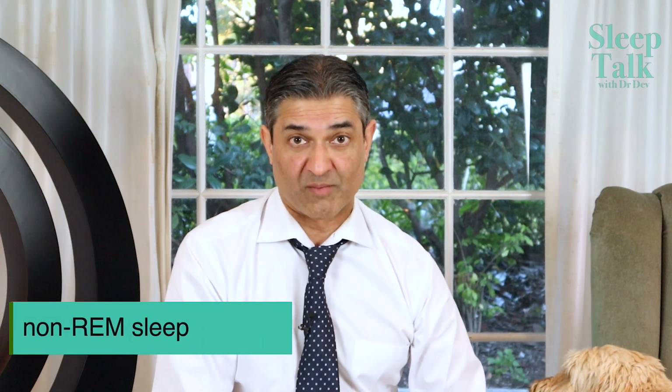This time we're going to talk about the sleep test results and maybe give you a reason why you're not sleeping well. So when your sleep doctor goes through the results with you, the first thing he or she will want to show you is how well or how good you sleep. Now, the important thing from the brainwave pattern, do you remember you have the forehead gadget? It'll tell us how much time you spend in dream sleep or rapid eye movement sleep and how much time you spend in non-REM sleep or non-dream sleep.